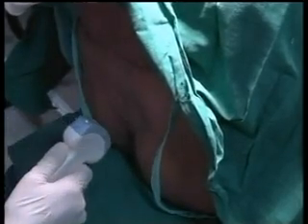Your patient is in sitting position just now because we are using the same patient. We are using the same probe, and the same patient is going to have a cervical epidural also. So she's in sitting position. Okay. This is obviously the bottom of her back.